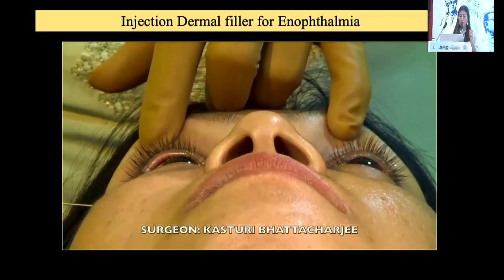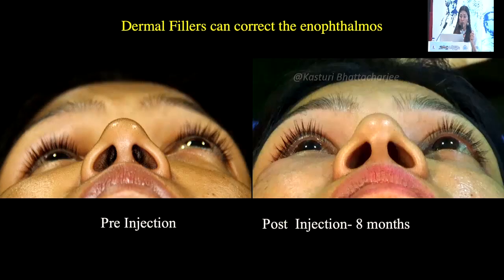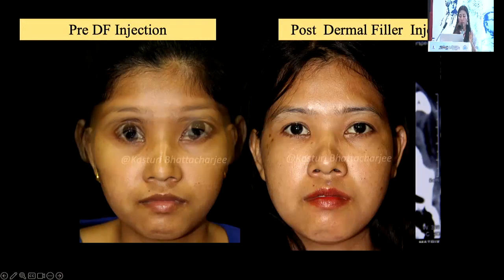And then you can see I'm monitoring the pupil in every step. This is look to the right. This is just after the procedure. And you can see the correction of enophthalmos. This is post-operatively. And I've been following her for more than 3 years now. And she is not requiring any further augmentation.